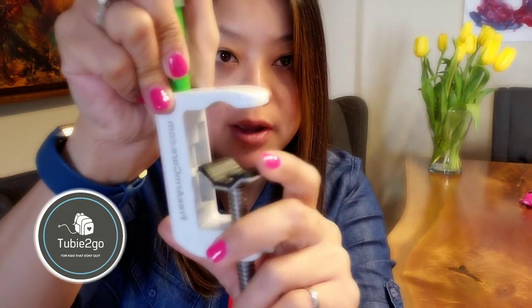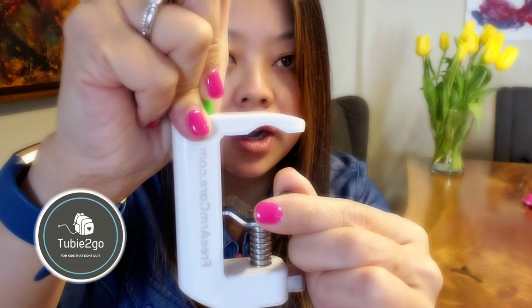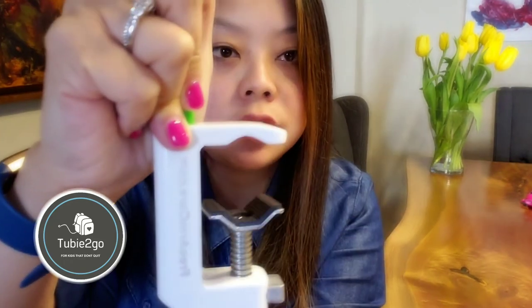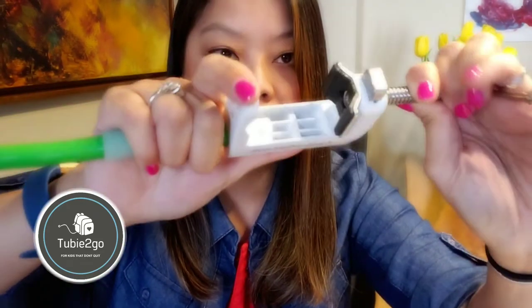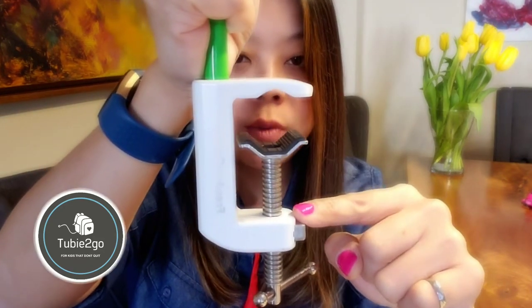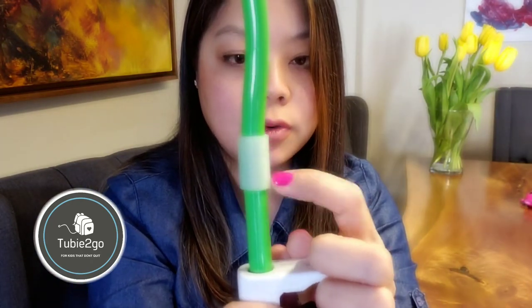This is not your typical cell phone holder type of alligator clamp — it's way sturdier. The best part is that it will not only secure onto flat surfaces, but because of this cup-shape design, it will also screw onto anything that's rounded. I've clipped it onto the bar of my son's swing, for example. It's got a spring-loaded feature where you can easily adjust the width, and the tolerance for what you can screw it onto is quite a bit wider than cheaper cell phone holders.